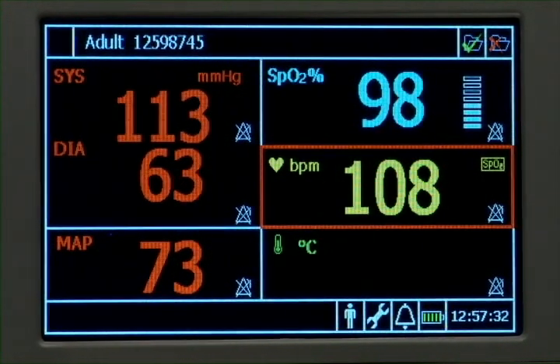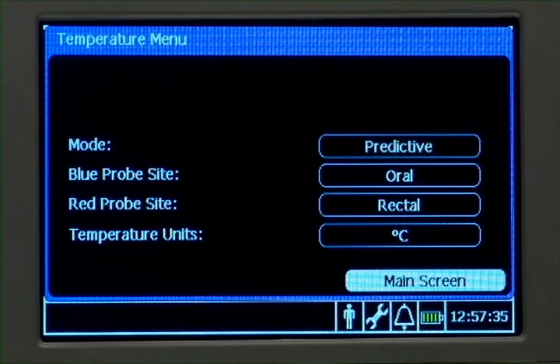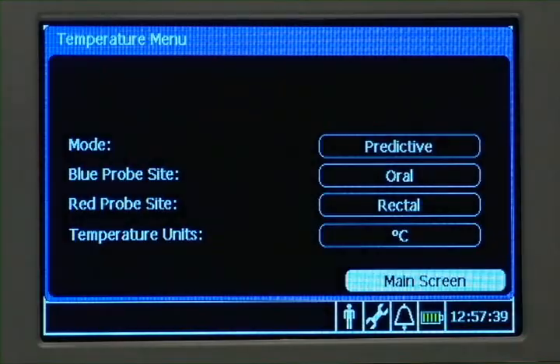Highlight and select the temperature numeric pane to change probe site, switch between predictive and monitoring modes, and change temperature units.